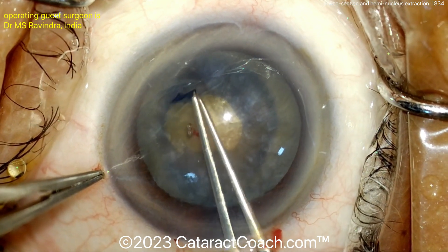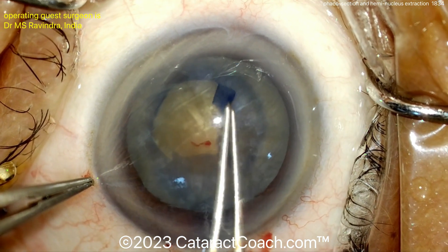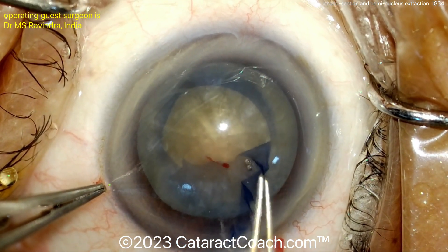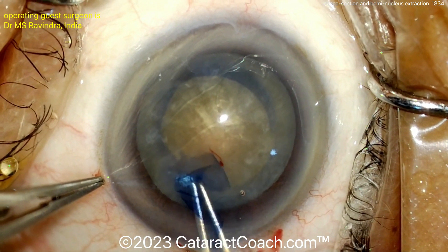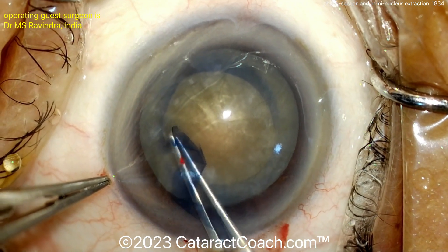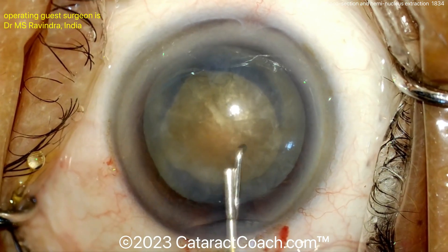This one obviously has to be more generous — you've got to have at least five millimeters; I'd say even five and a half to six millimeters. Because you want to get this entire nucleus to prolapse out of the capsular bag. If you have too small of a rexis here, you're not going to be able to do that. So definitely get this rexis to be a generous one. In a patient like this with essentially minimal or no preoperative vision, remember the most critical thing is not necessarily overlap by the optic for 360 degrees.